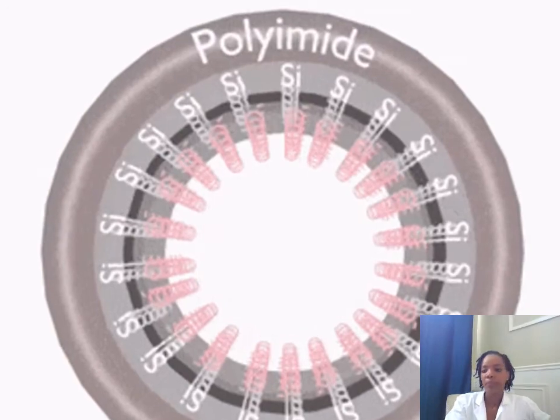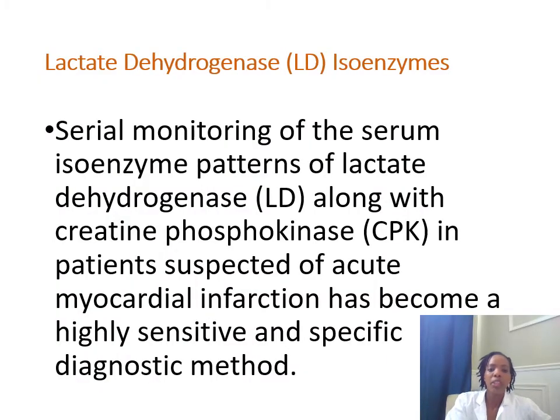LD. Serum isoenzyme patterns of LD, along with CK, in patients suspected of acute myocardial infarction have become a highly sensitive and specific diagnostic method.